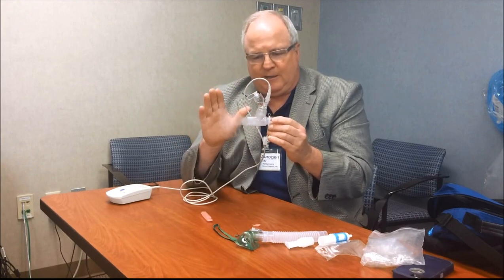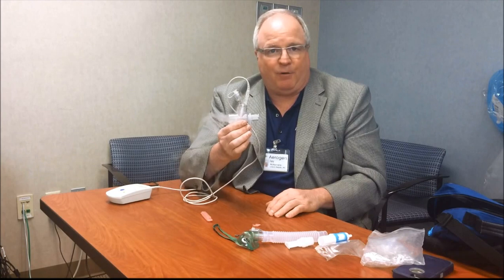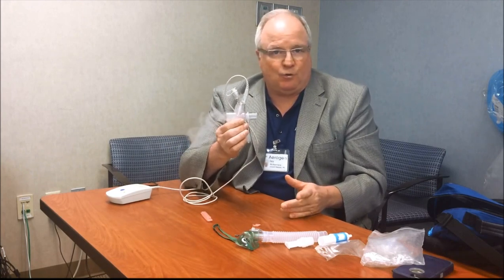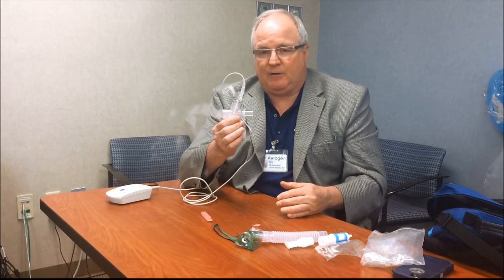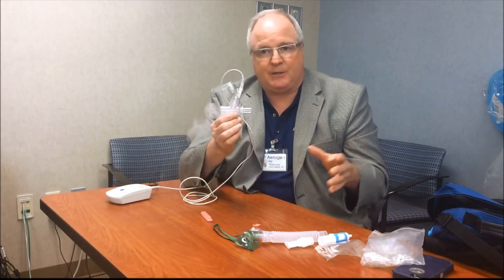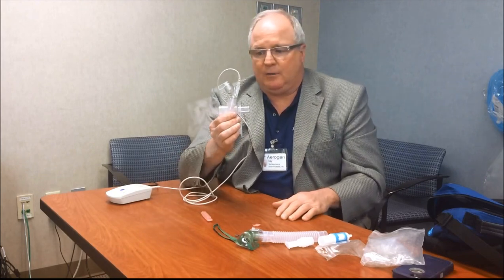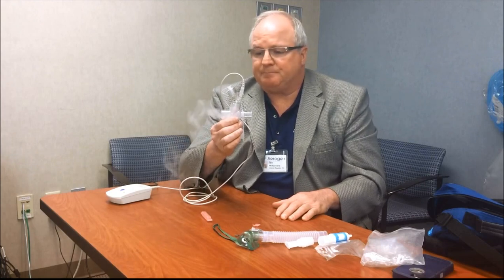Now you won't hear anything, and also because it's electronic, there won't be any added flow or pressure. So there's no flow, you're not going to change your FiO2 at all because you're not adding air or oxygen. You're also not changing the dynamics of your ventilator parameters because you're not adding flow, so you're not going to change your pressure, peak flows, or any of that. So you don't need to really worry about expanding your alarm volumes or decreasing your pressure or volume settings.